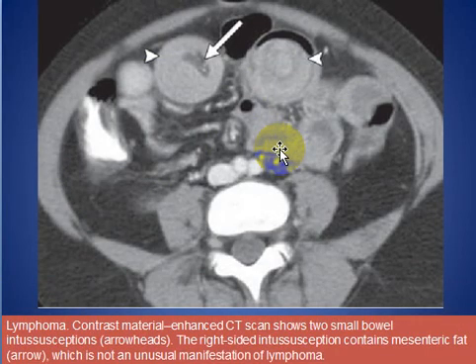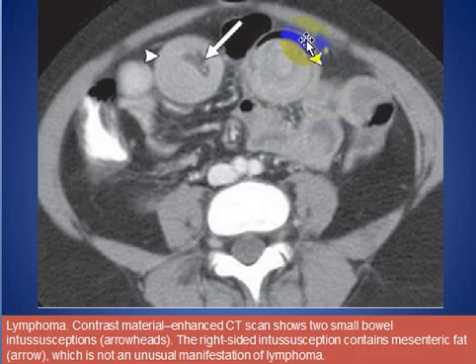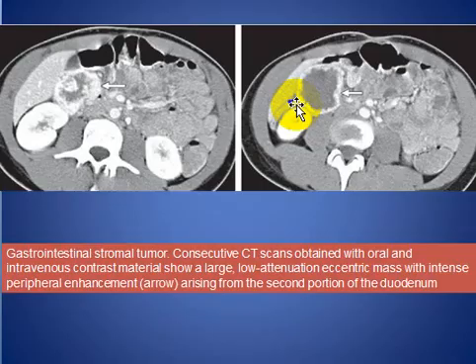Here is a CT scan after oral and IV contrast in a patient with lymphoma with intussusception. The right-sided intussusception contains mesenteric fat, as we see here. This is also the intussusception in a patient with lymphoma.